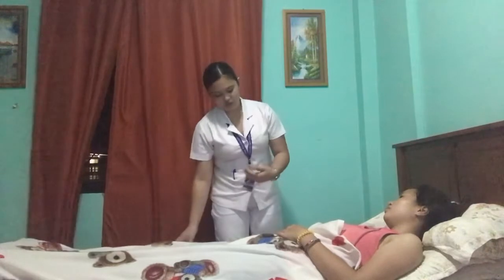Since you are unable to take the medication orally, we're going to proceed through subcutaneous injection. So, let's start the procedure. Yes, nurse. So, let's determine which side we'll use.